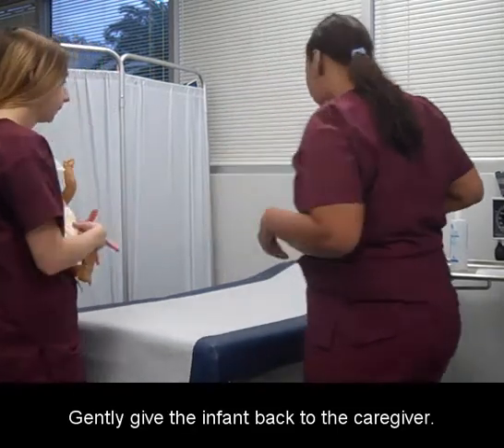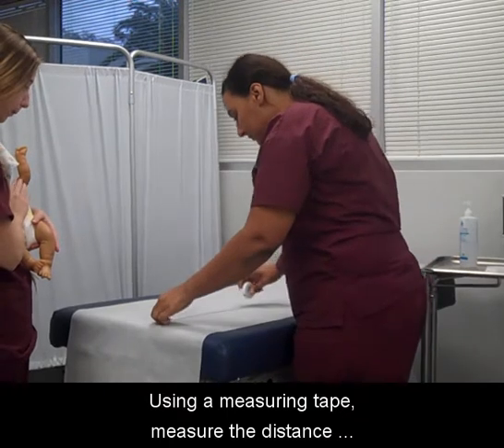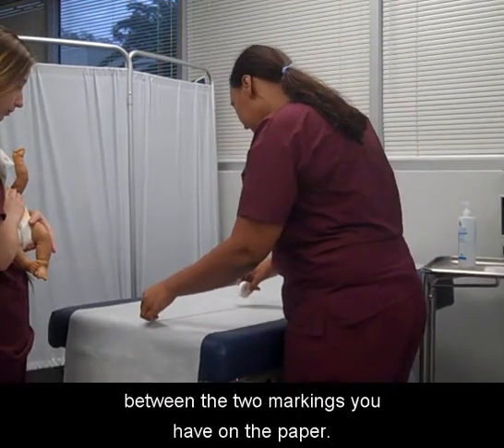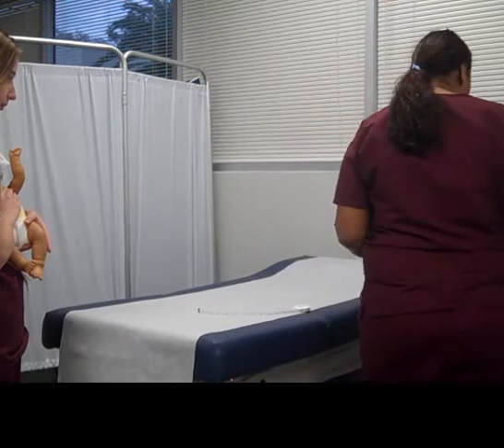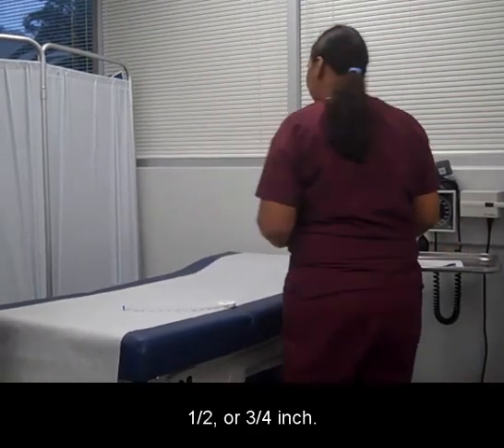Gently give the infant back to the caregiver. Using a measuring tape, measure the distance between the two markings you have on the paper. Read the length in inches to the nearest quarter, half, or three-quarters inch.